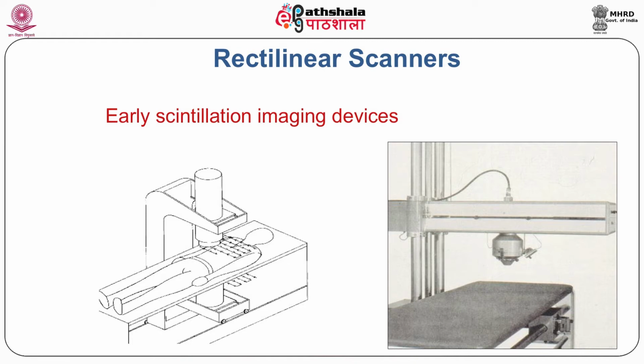So, this was the earlier device which was utilized, but because of the change in technology, now we are talking about PET and SPECT. The reason is that during those days when this particular device was used, we used to get images in a dot matrix kind of image, and doctors may not be able to find out at which region and at which depth a particular disease is located, because all our organs are three-dimensional in shape.